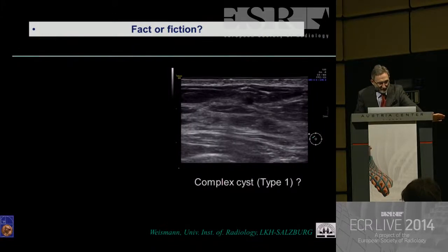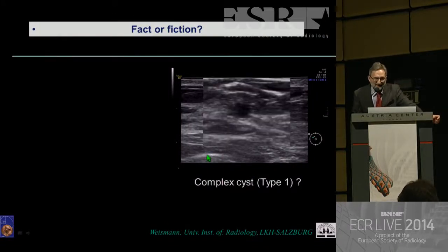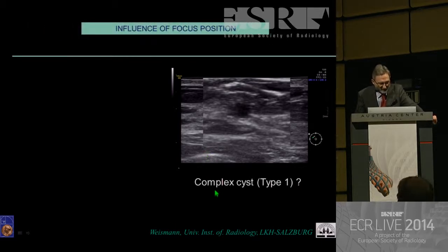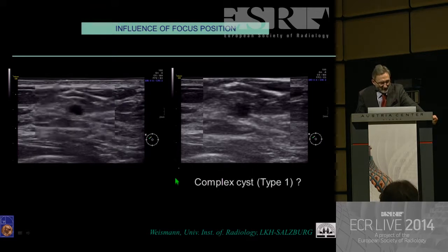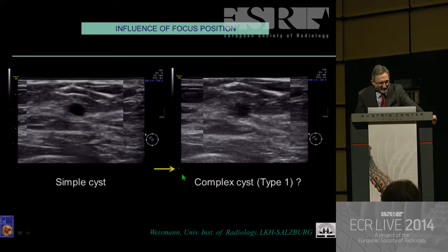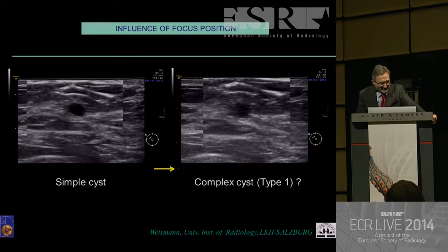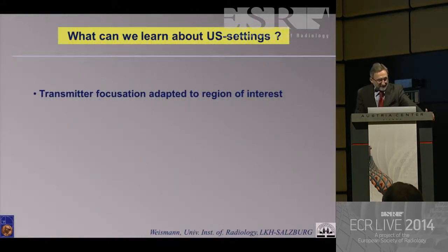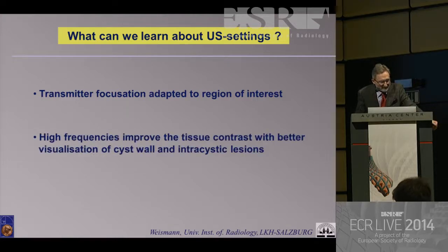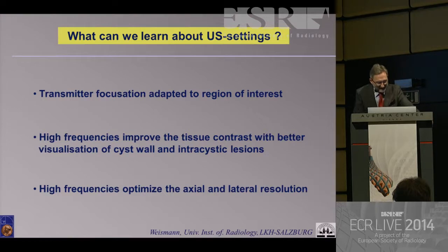Fact or fiction: is this a complex cyst or a solid lesion? This is the same structure — it's completely clear it's a microcyst, just a focus close to the chest wall and the lesion is completely out of focus. You have to keep an eye on whether the settings are in a proper position. The transmitter focus must be adapted to the region of interest. High frequencies improve tissue contrast with better visualization of the cyst wall and intracystic lesions, and optimize axial and lateral resolution.